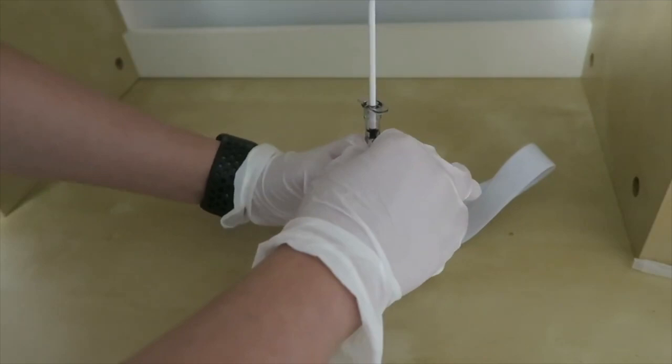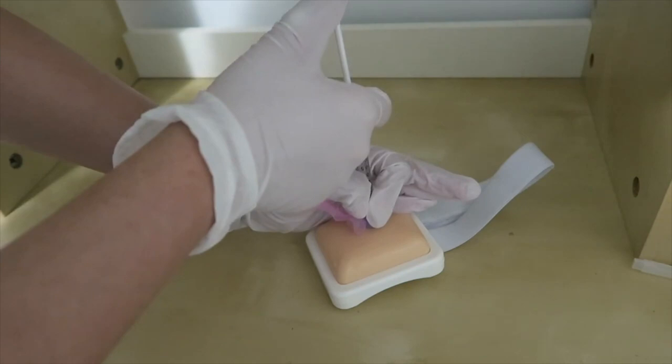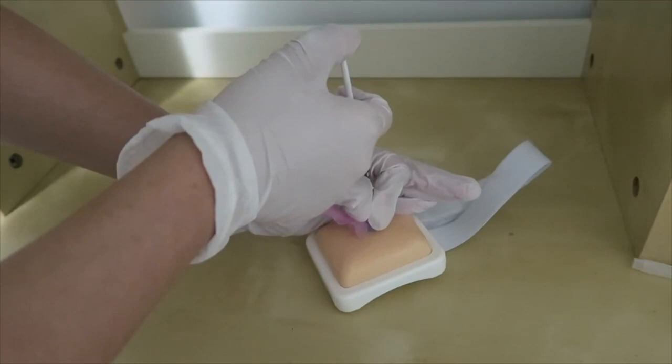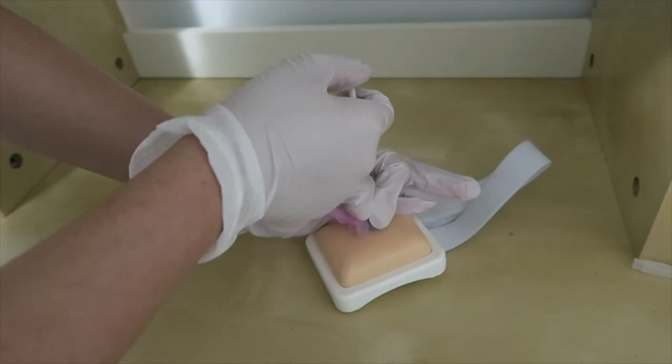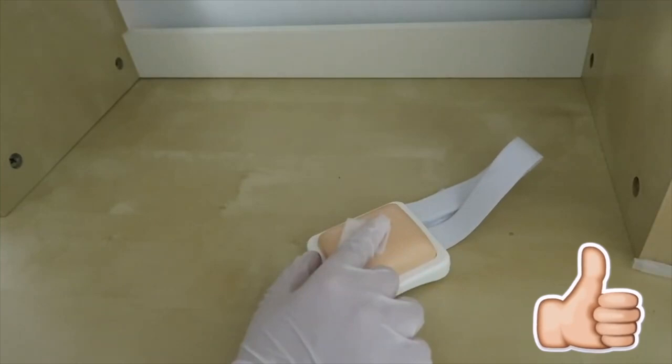And I'll stabilize the base of the needle with my thumb and my index finger like so. And now I'll be injecting the medication slowly at a rate of 10 seconds per milliliter. So we don't actually aspirate for intramuscular injections. So I'll just remove the injection like so and cover it with gauze and apply light pressure.